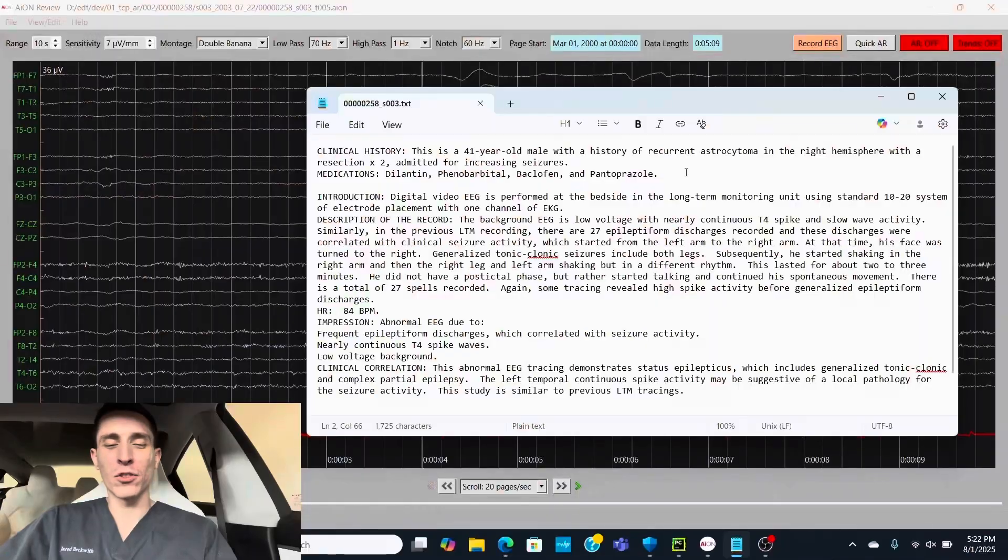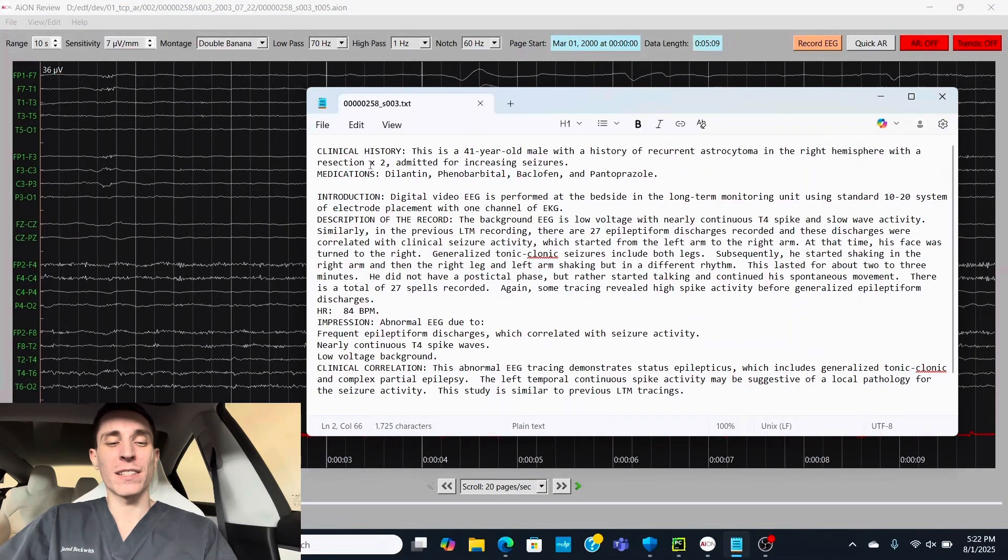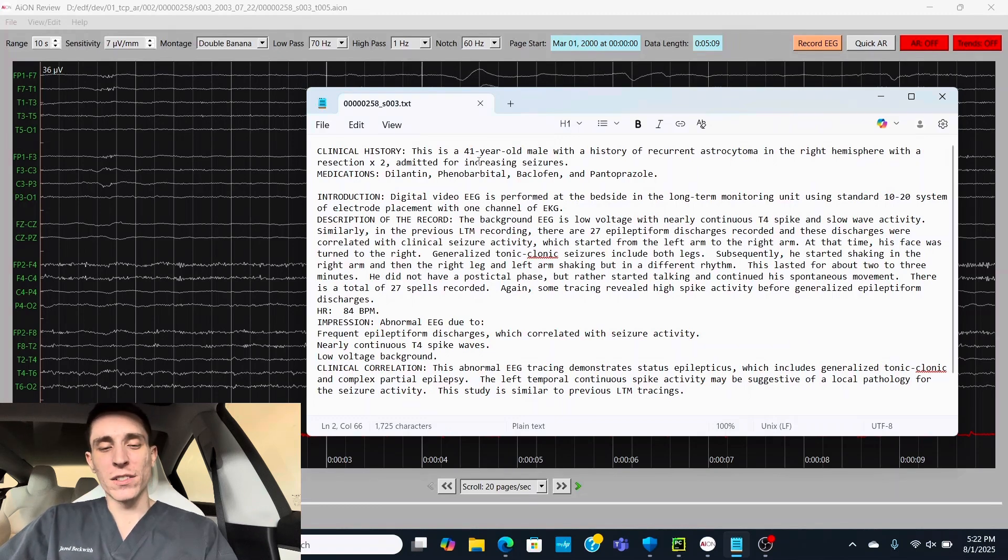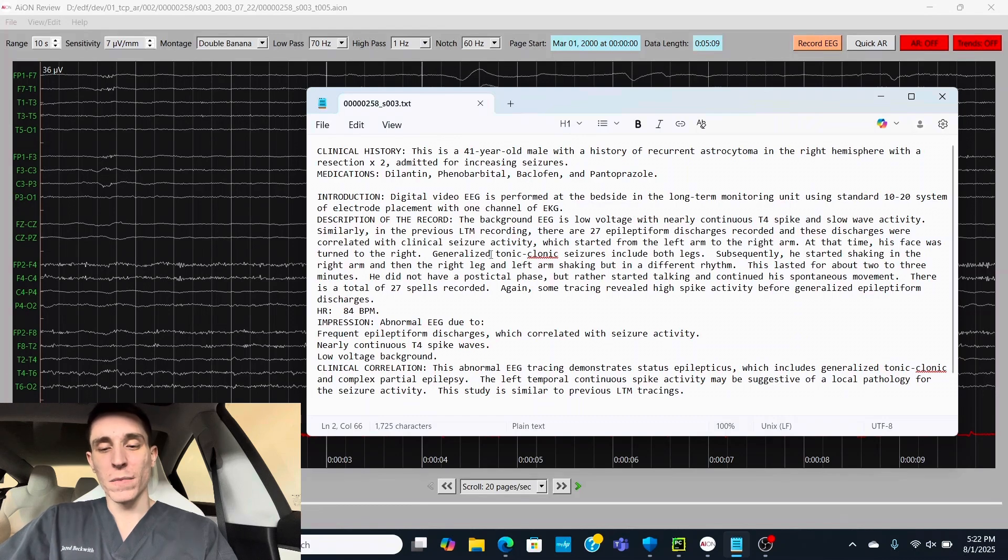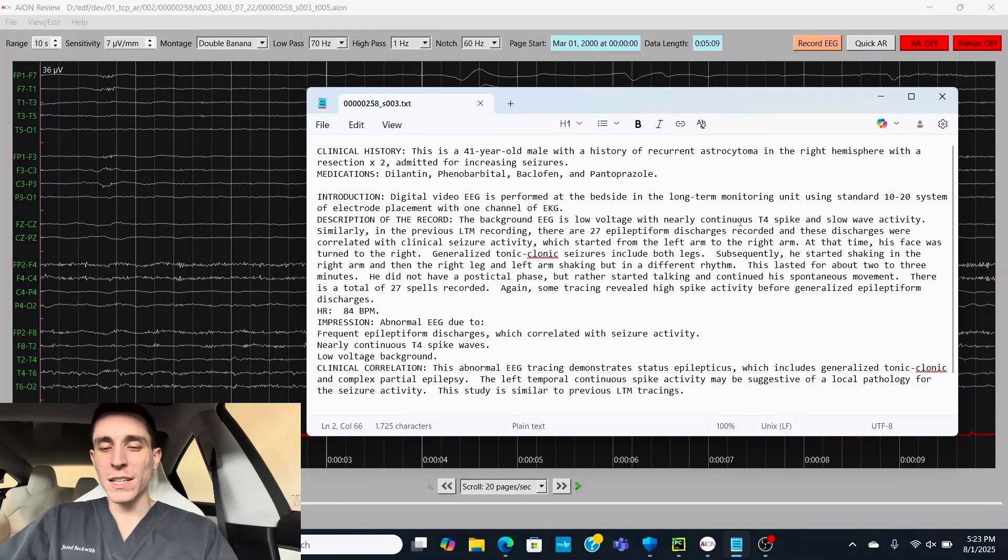You've got the astrocyte cells, they're multiplying uncontrollably and it seems this patient has had a resection two times. So despite having two resections, they're still having increasing seizures. Now they came into the hospital, had their EEG done. Now it's continuously low voltage. We're going to go through the EEG in a second.